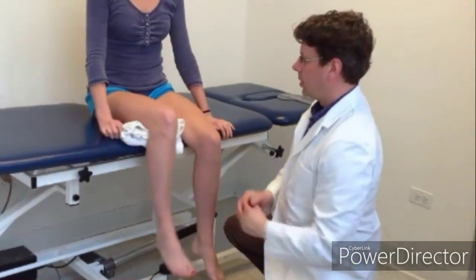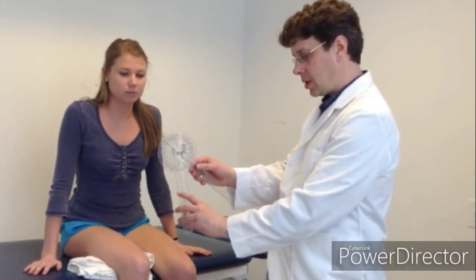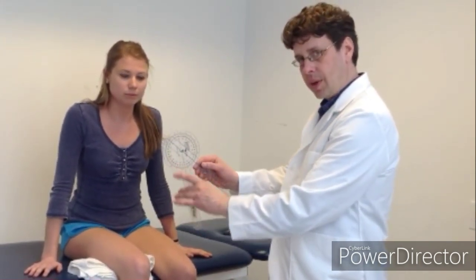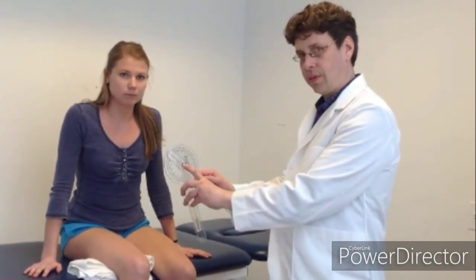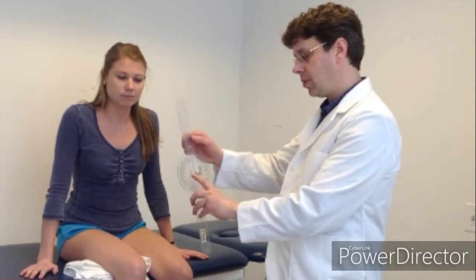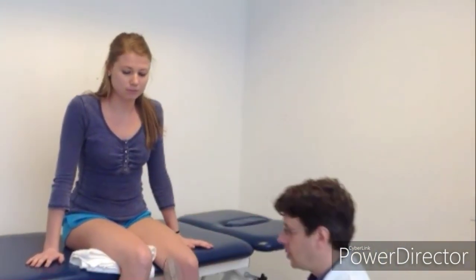adduction at the hip. So before I even use the goni, I just wanted to make clear what we're talking about. This is the stationary arm. This will remain stationary. This is the axis. This is the point from which I will be moving the movable arm of the goni. So I line that up as so.